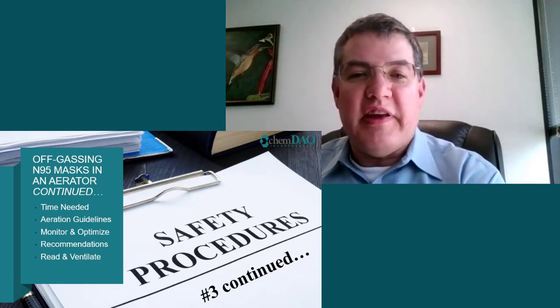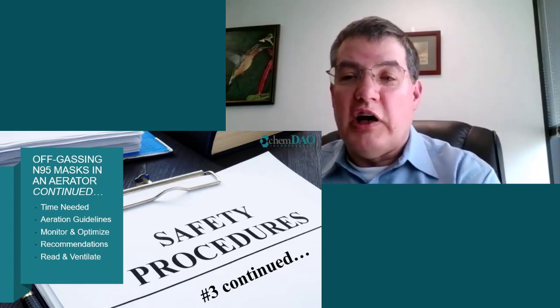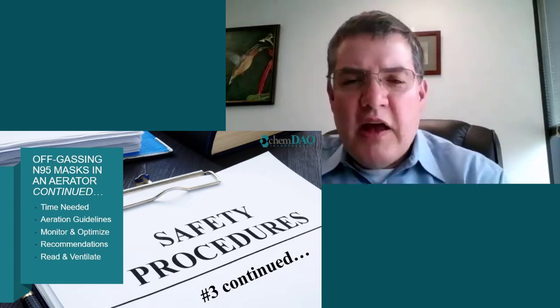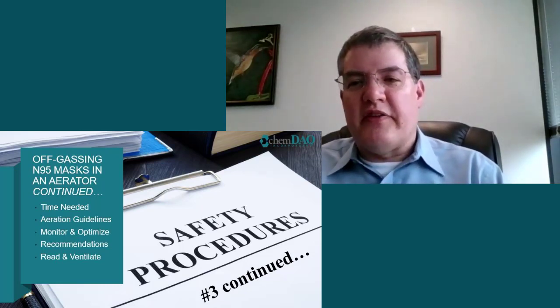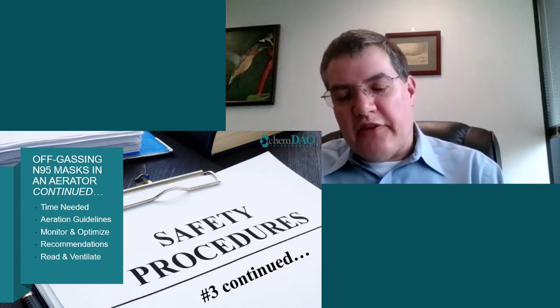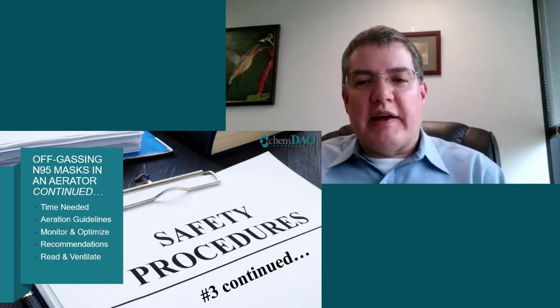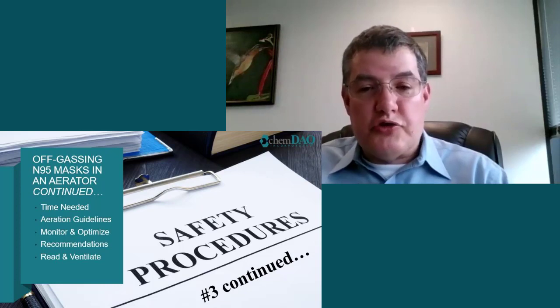Hydrogen peroxide has essentially no odor, and so if there was a leak, users would not know until it was so high that it was stinging their eyes. Some models of sterilizer do a better job of removing hydrogen peroxide vapor at the end of the cycle, and others not so well. For the latter, having a cloud of 20 to 50 ppm hydrogen peroxide come out of the sterilizer when the chamber is opened is not unusual.